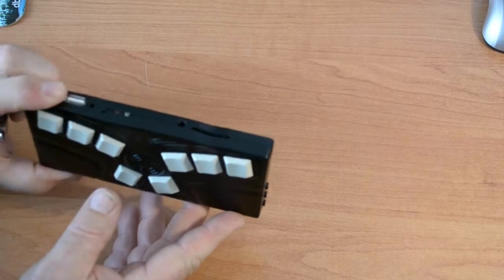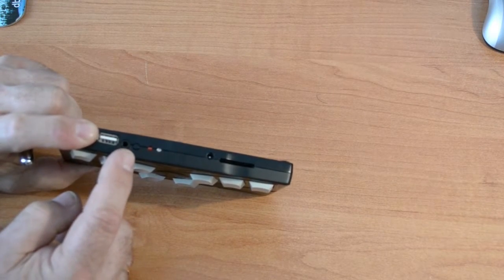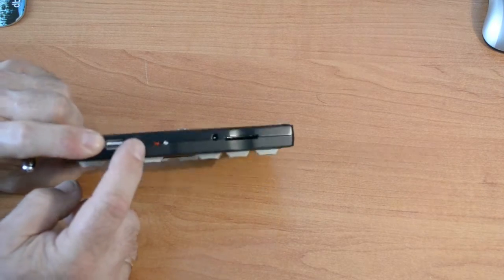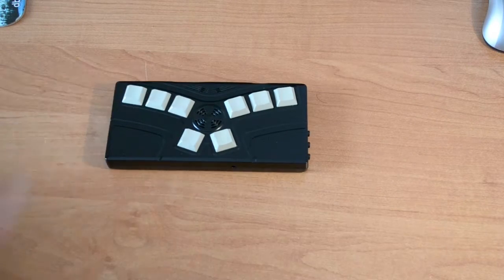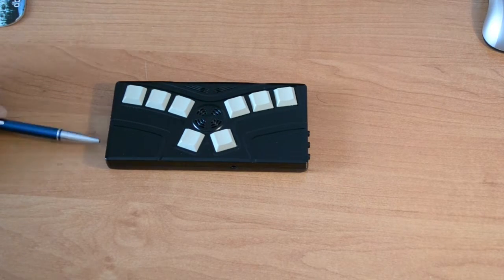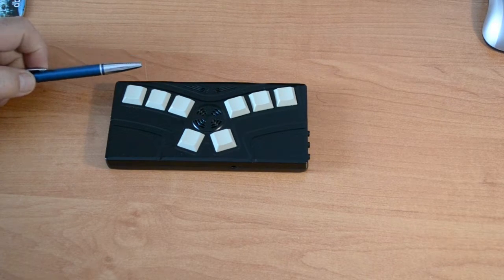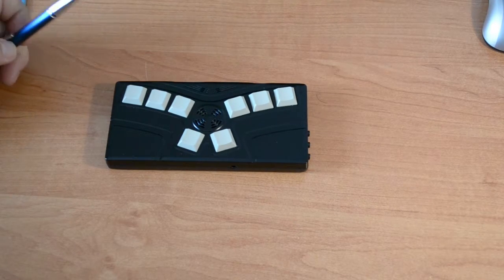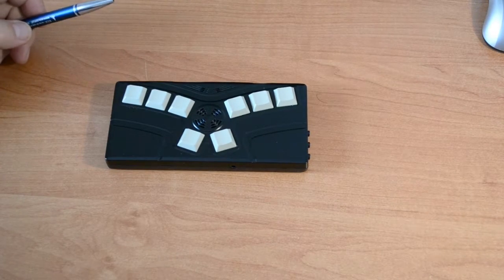To switch the device on, we have to use the switch button. We have to press it just shortly, and then after a few seconds the device will be ready to work. We can connect to this device an SD card, a USB memory stick, headphones, or an external audio signal.